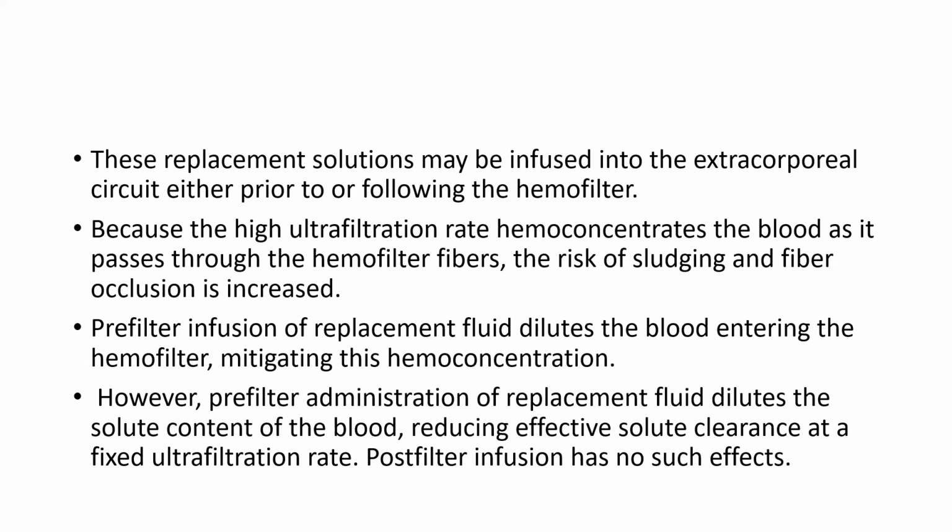This replacement solution may be infused into the extracorporeal circuit either prior to or following the hemofilter. Because the high ultrafiltration rate hemoconcentrates the blood as it passes through the hemofilter fibers, the risk of sludging and fiber occlusion is increased. Pre-filter infusion of the replacement fluid dilutes the blood entering the hemofilter, mitigating this hemoconcentration. However, pre-filter administration of the replacement fluid dilutes the solute content of the blood, reducing the effective solute clearance at a fixed ultrafiltration rate. Post-filter infusion has no such effect.